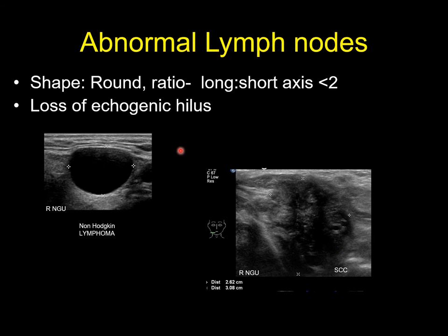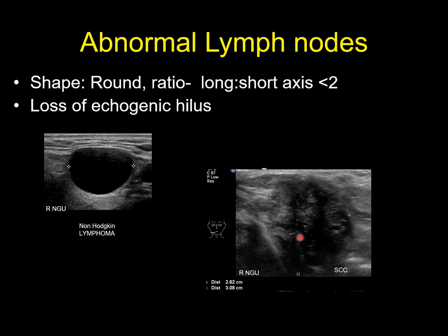An abnormal lymph node will look very different compared to the normal one. The shape tends to be more rounded, and if you measure the ratio of the long to the short axis, this tends to be smaller than two. As you can see here, there is a loss of echogenic hilum — this was found to be a non-Hodgkin lymphoma. If you take the long axis over the short axis, you'll find that this is below two, and here there is no hilum visible at all — this is an SCC node. You can see it is also heterogeneous in echotexture internally.